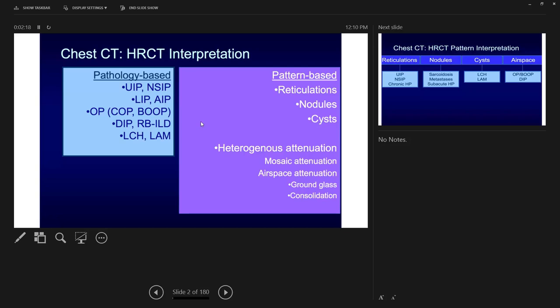The major patterns we discuss are reticulations — linear scarring in the lungs — or nodules. When you see nodules, you can define whether they are solid or ground glass, and importantly, whether they are in the center of the secondary lobule or whether they follow the bronchovascular or lymphatic route. More nodules along those areas suggest a lymphatic-related disease such as sarcoidosis.